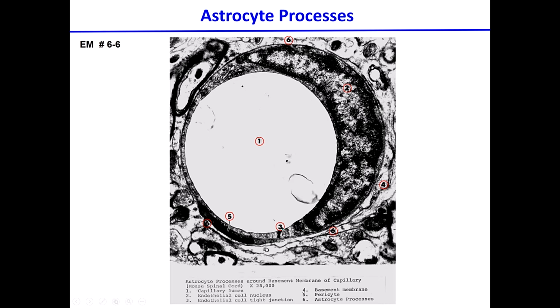And this is the endothelial cell, and this is the nucleus of the endothelial cell. There are some interesting structures here that are so-called tight junctions. Again, the endothelial cell is wrapping and creating the capillary, and at the opposite end, what would be the mesaxon for a Schwann cell wrapping something, this structure in endothelial cells forms a tight junction.